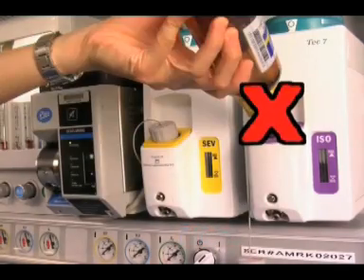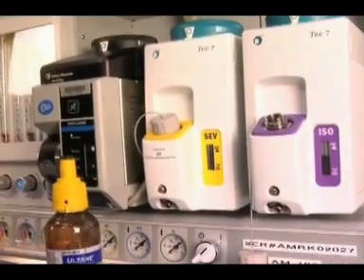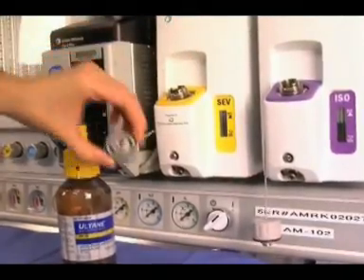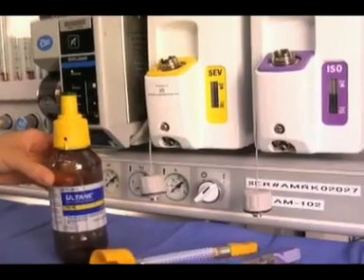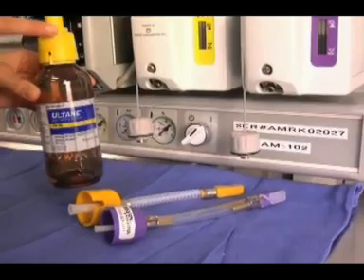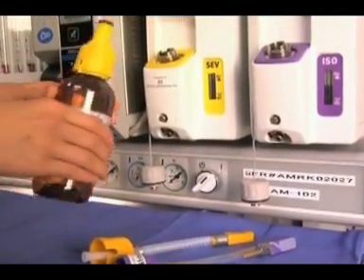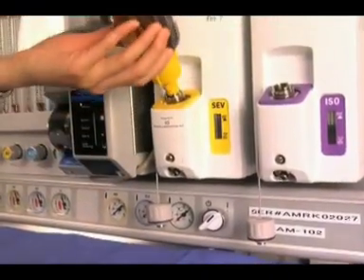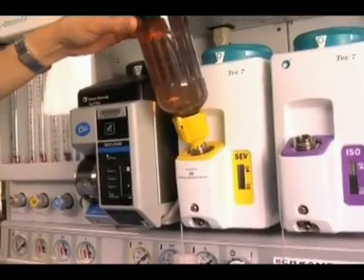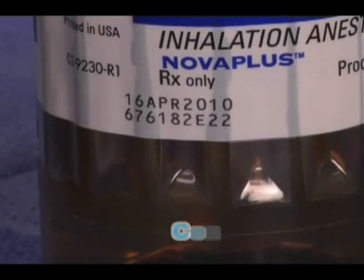Hazards and safety. Misfilling. Filling a vaporizer with the wrong agent can inadequately or excessively anesthetize the patient, depending on which drug is placed in the vaporizer. The Aestiva vaporizer is equipped with specific key fillers to eliminate error. However, some Aestiva machines do not. Therefore, it is important to carefully read the label to make sure it is the right agent going into the vaporizer.